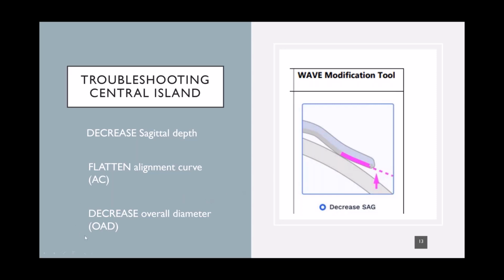Sometimes this is a situation where maybe decreasing the overall diameter is a better strategy. And the key here is to really look at the lens on the eye to figure out if your diameter's too big or too great. Sometimes these corneas are more oval in shape rather than completely round. And if you are measuring your horizontal visual iris diameter and you're getting one thing, sometimes if you measure a vertical visual iris diameter, you'll see that their cornea is much shorter vertically than it is horizontally.